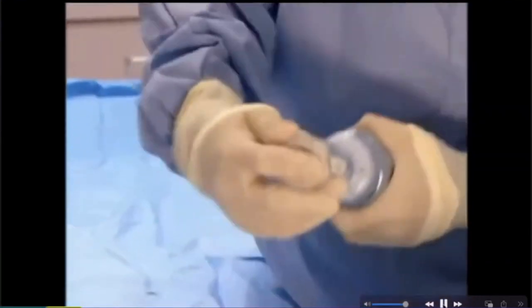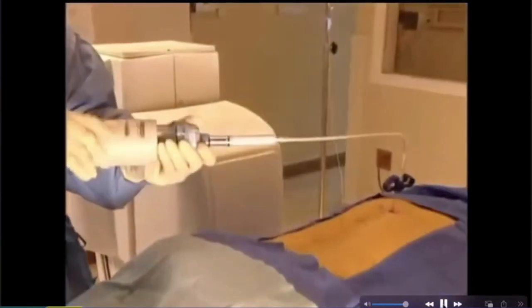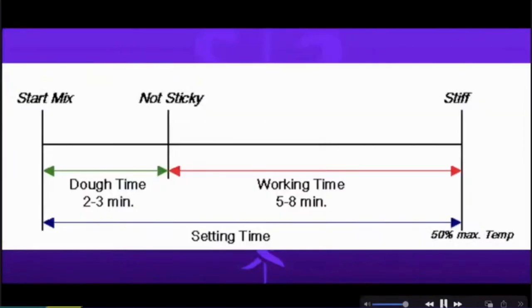And this is how it has been injected. They are good from an injection point of view, but the exorbitance is there. If you have your own indigenous method, I think that is more welcome, and that's very easy to do. I'll show you that after these slides. You'll see my list of cases after this. And this is how it has been done. It's a very graded kind of thing. So gradually you inject cement in, and if you don't like how the cement is going, you stop.